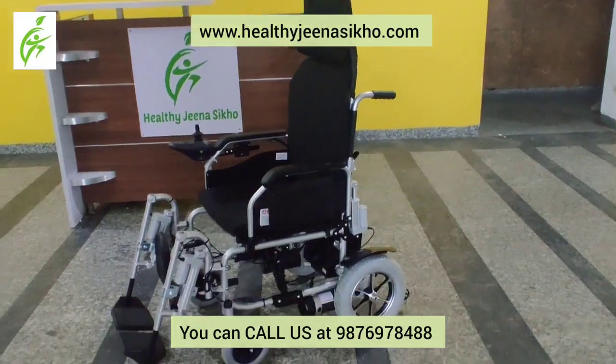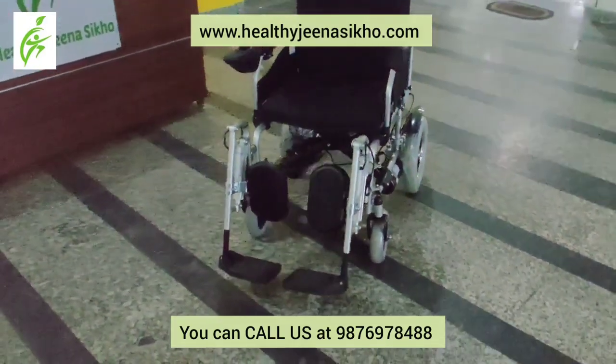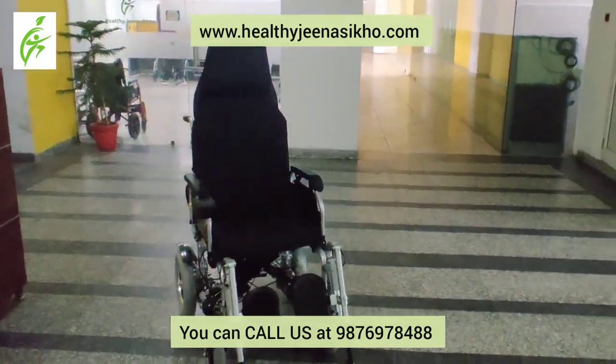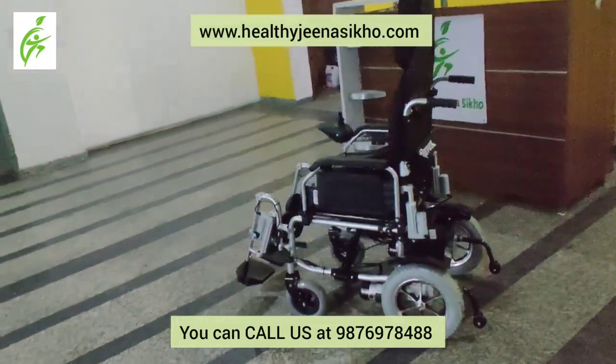Let's look at the Evox C104R Reclining Motorized Wheelchair. This wheelchair can be very comfortable for your patient or loved one. Let's look at how you can use this wheelchair.